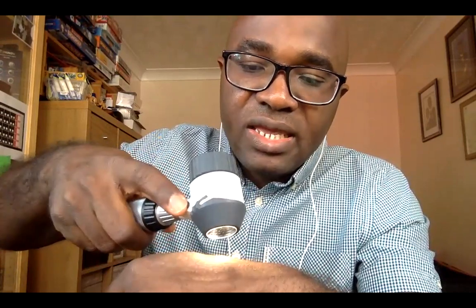Once I switch it on, you can see the lights come on this way. These buttons can switch between polarized and non-polarized lights, so that can help you in appreciating some more lesions.